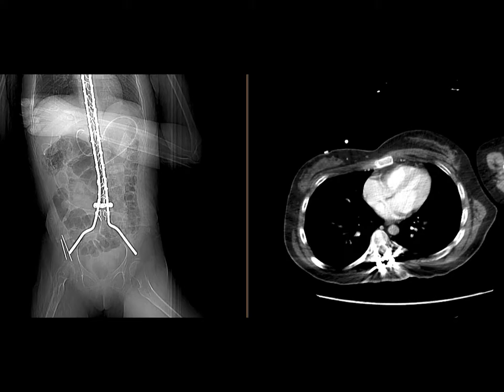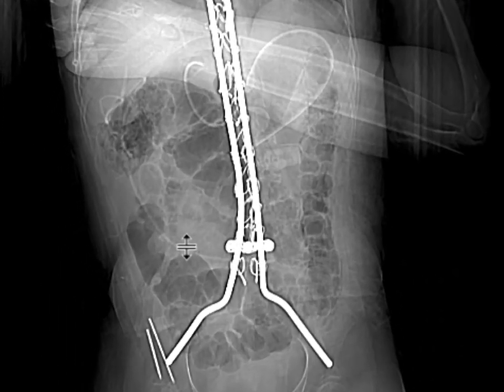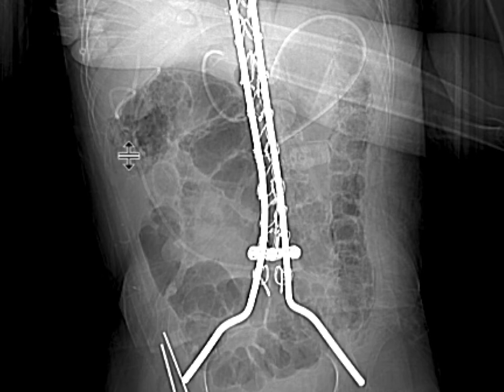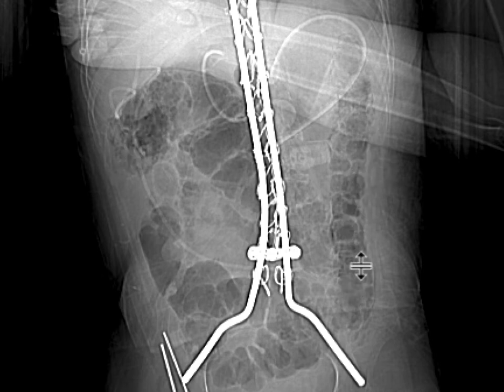This is a patient who came in with abdominal pain, got a CT scan, and we can see on this scout radiograph there are some abnormal lucencies surrounding loops of large bowel here at the hepatic flexure, here in the descending colon, and that in itself is concerning for bowel pneumatosis.